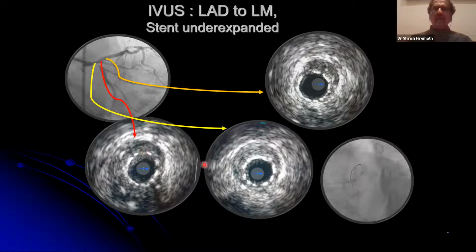And this could be one of the reasons why the side branch also is getting caught into the ISR. Many times we address the side branch with a balloon to open up the stent struts so that the flow to this is well maintained. Even that balloon can traumatize the tip of the side branch.